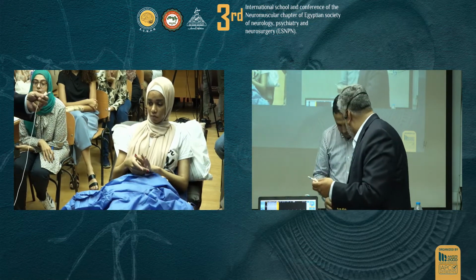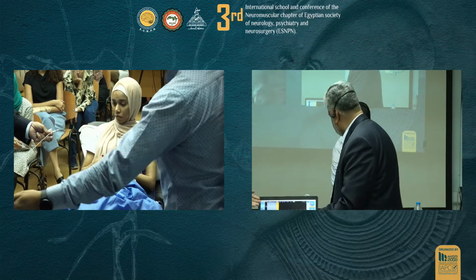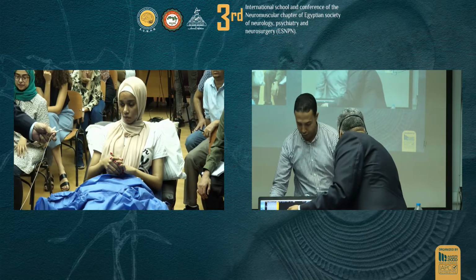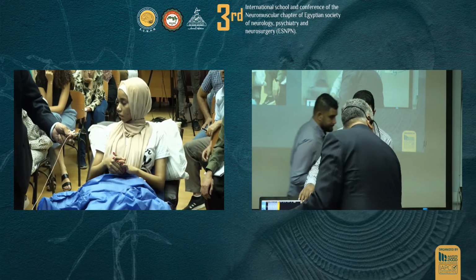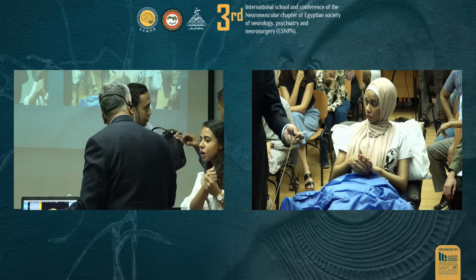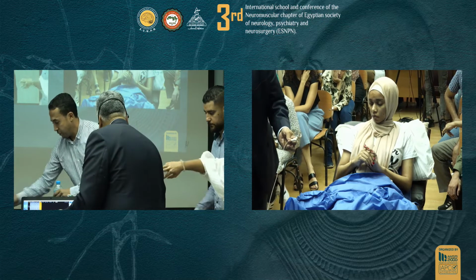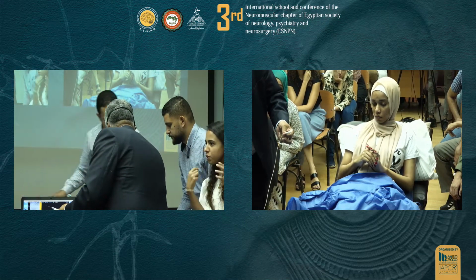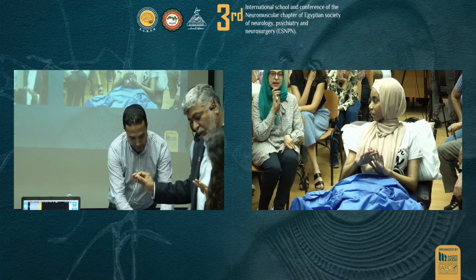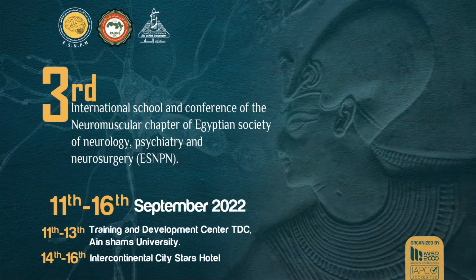So can you make it a bit closer over here? Put it on tape because I can come here. I don't want to drop your, it's too far away. No, no, the whole thing needs to move. Just give me a second. Yes. I want to do both sides. I'll do both sides, one normal and just to check. Yeah. Okay, you do whatever you feel. Please go ahead. No, that's totally fine. You do what you need to do, please. I just want to make sure that you guys.